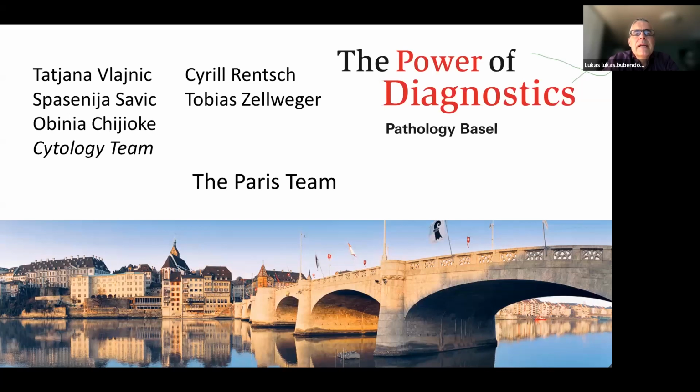How long can a treatment effect after BCG be seen in urine cytology? Well, the answer is I don't know, and the second part of the answer is it really depends on how you define a treatment effect. That's a continuous change. There is not a yes and no, but from my guess, I would say it's probably several months. It's not for years. It's not like radiation treatment where you see the effects for years. That's not the case for BCG.